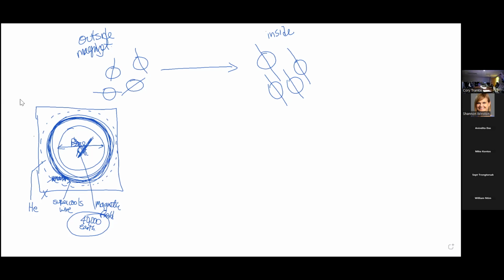So we've still got to make a picture, right? We're just sitting in there. So what happens next? The next thing that happens is there is delivery, believe it or not, of electromagnetic radiation, but it's not ionizing. It's in the form of an FM radio wave.